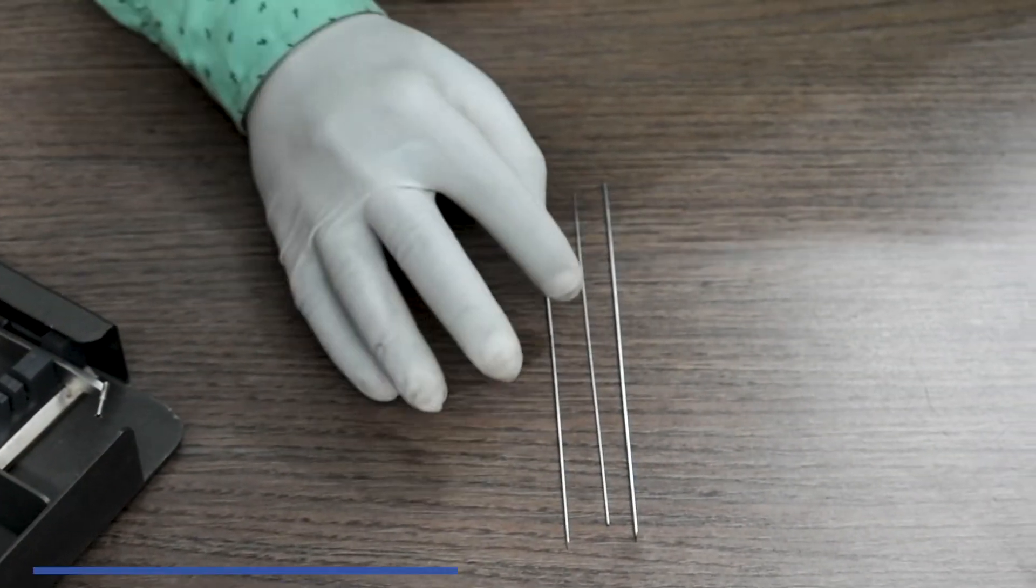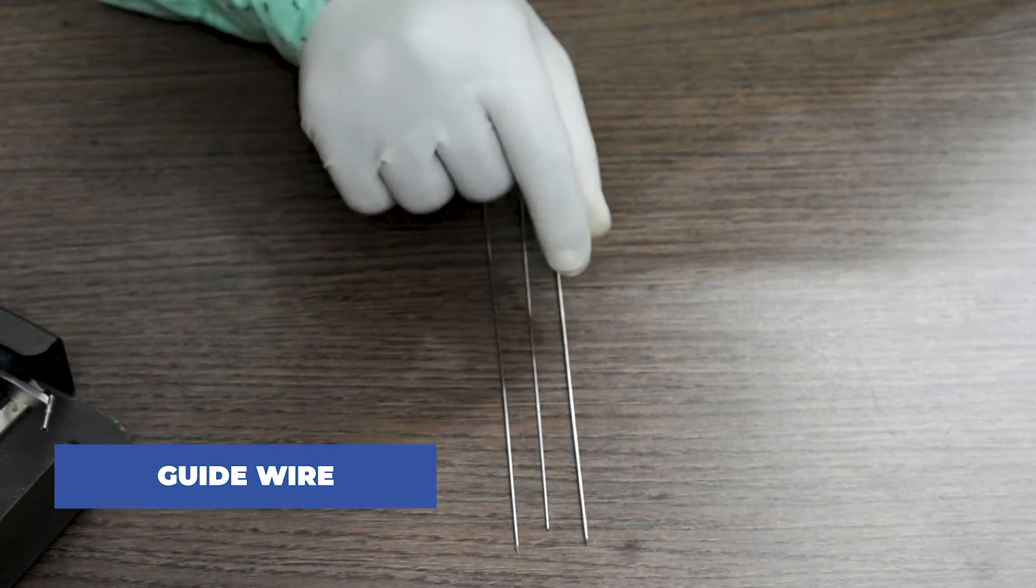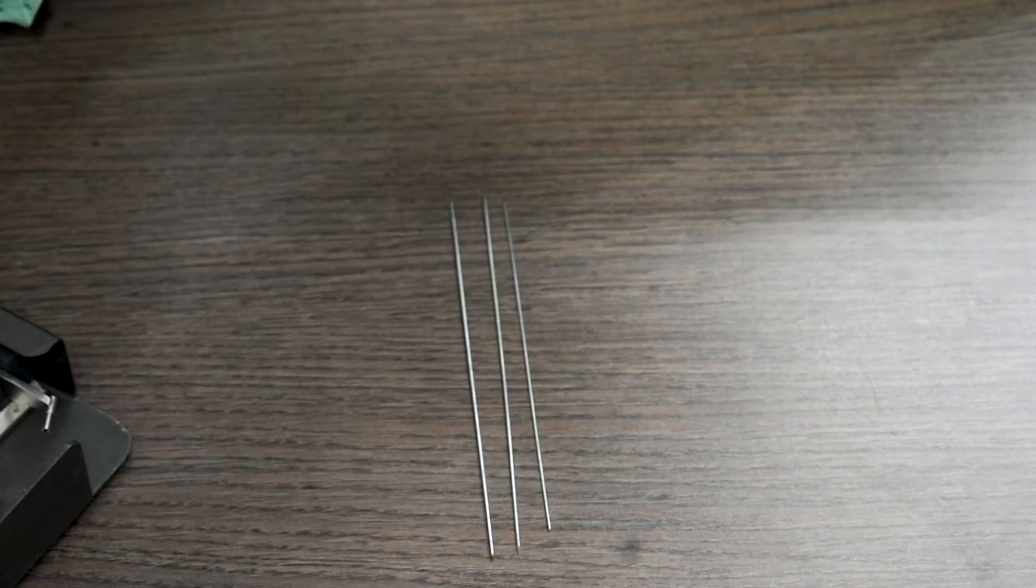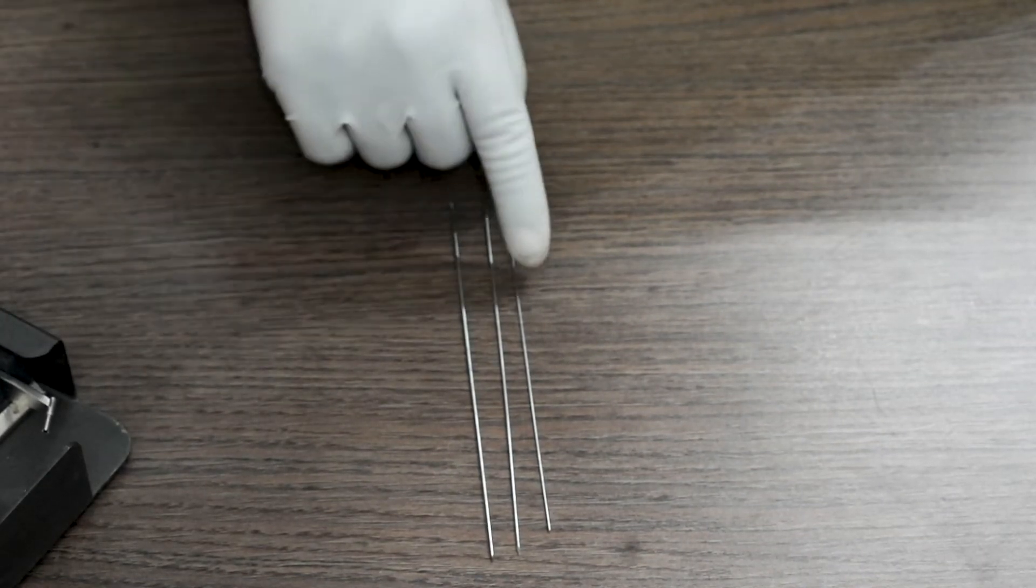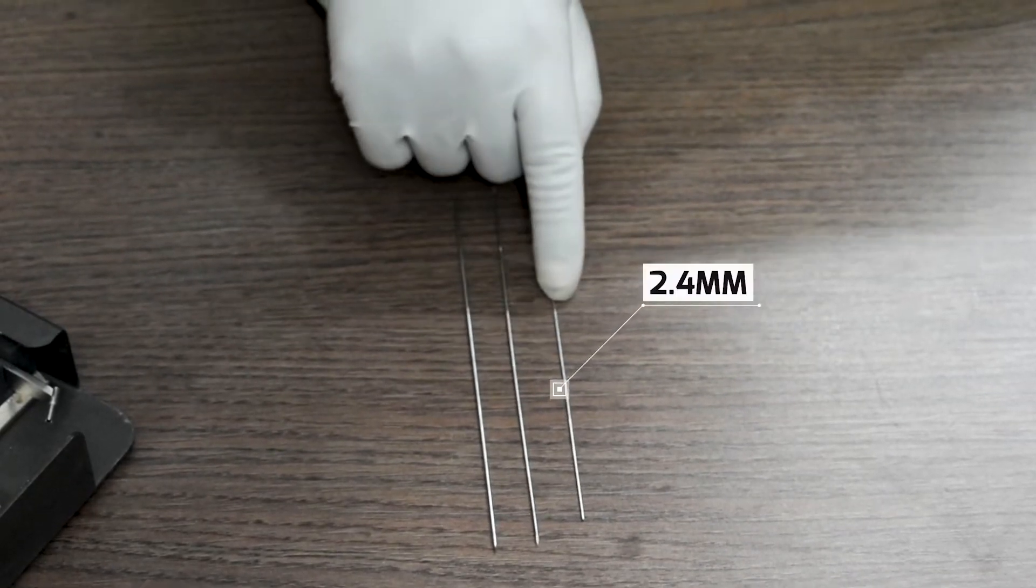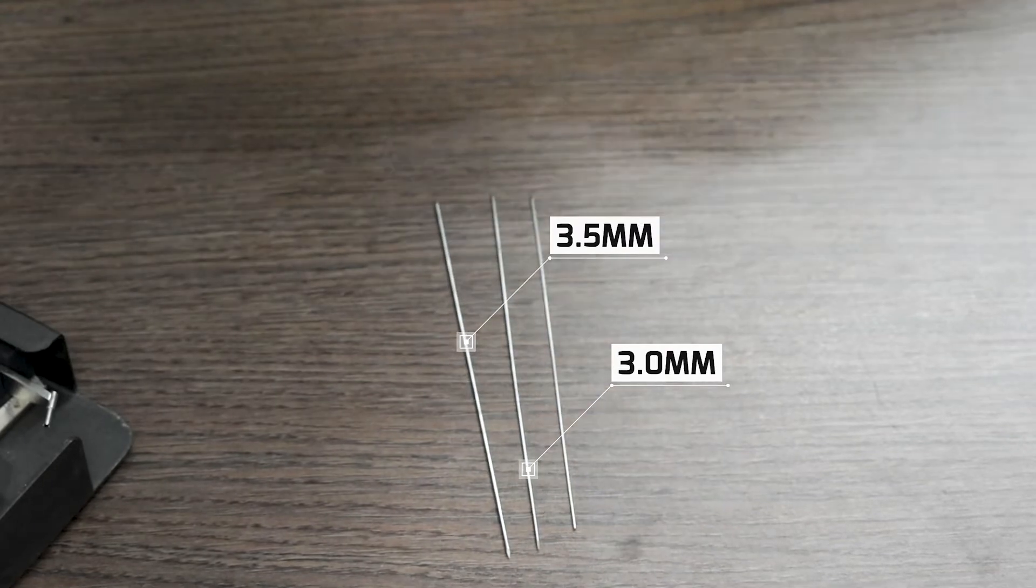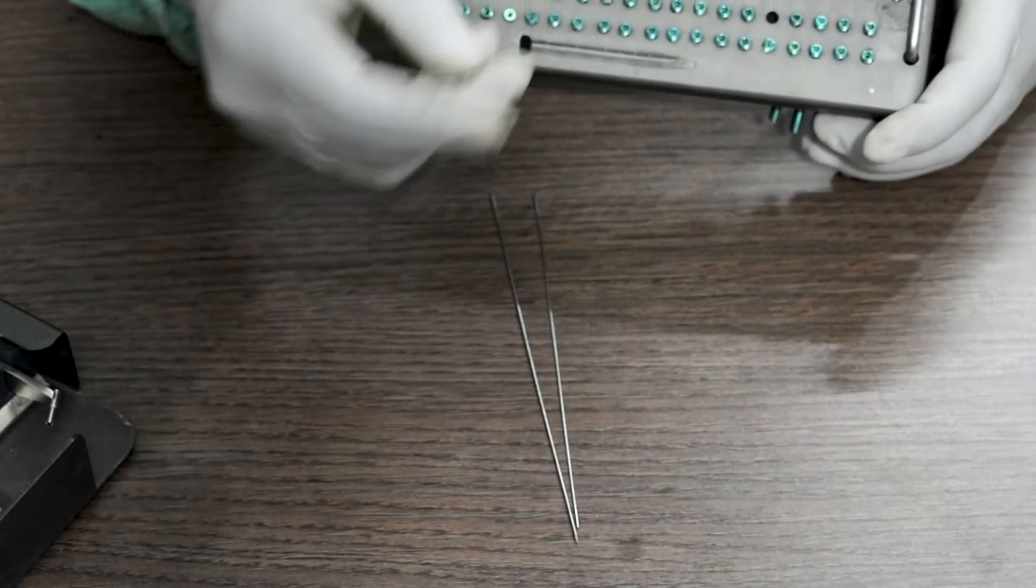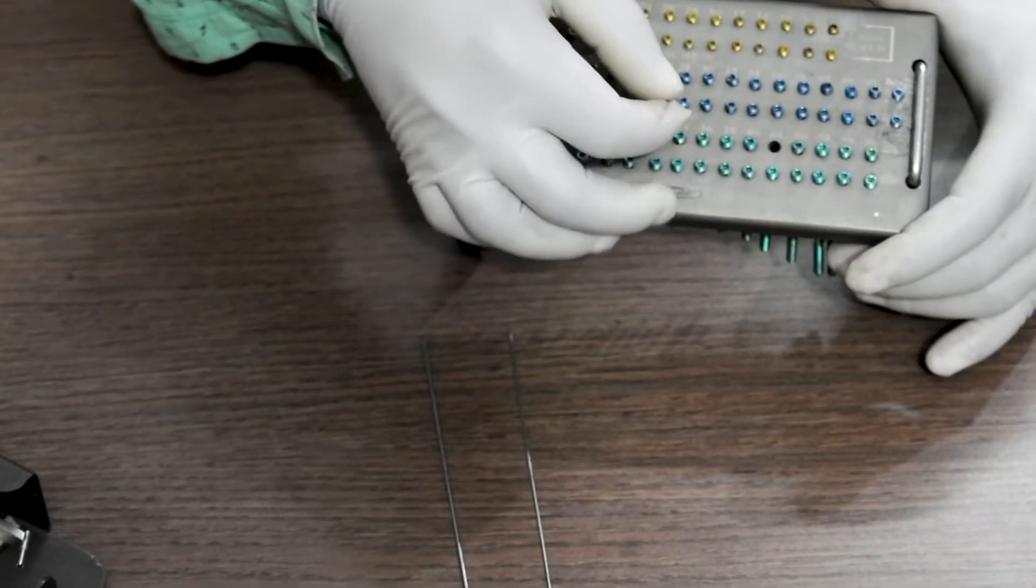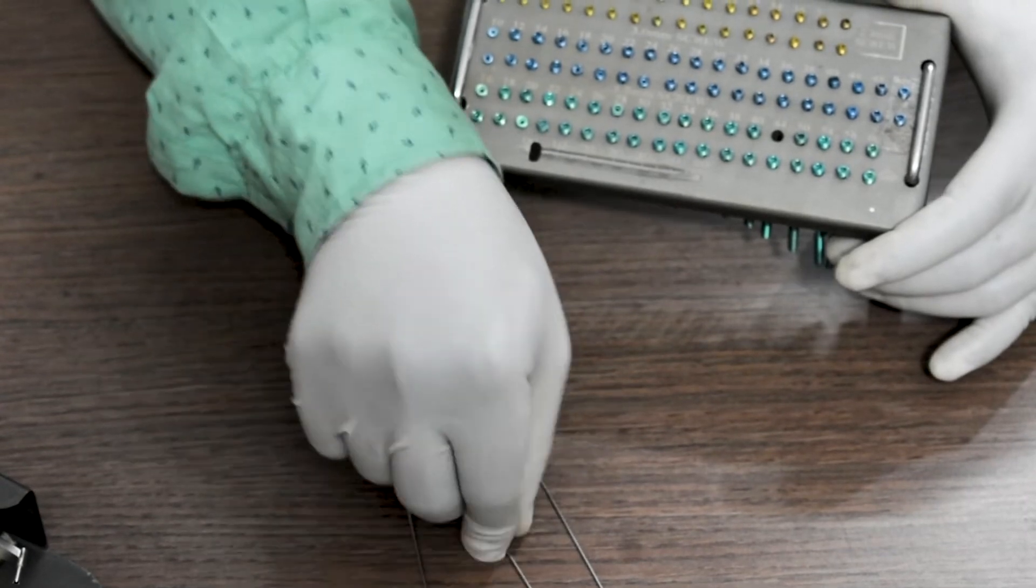Coming down to the guide wires required, these are called guide wires available in different diameters. This one is 2.4mm, this one is 3mm, and this one 3.5mm. These guide wires are used to direct the Special Herbert Screw in the fracture site.